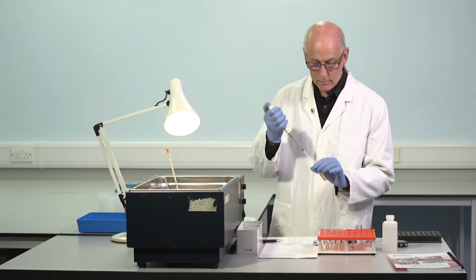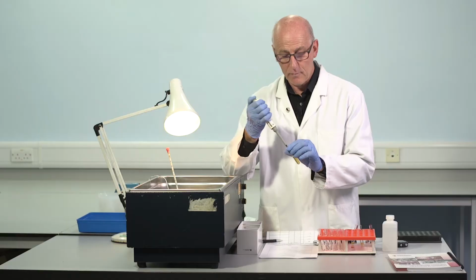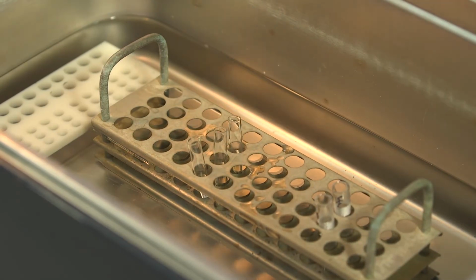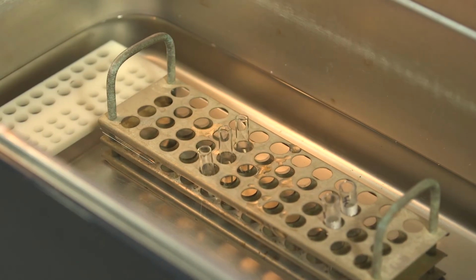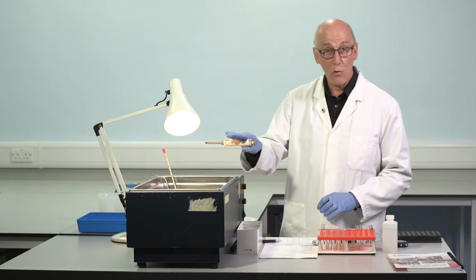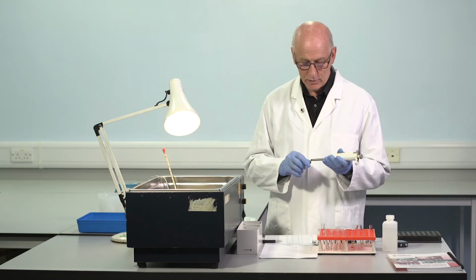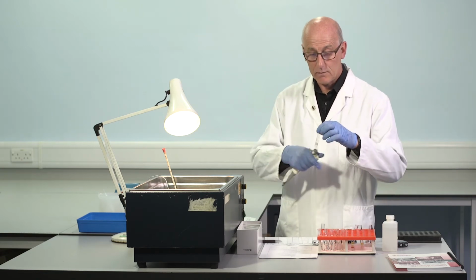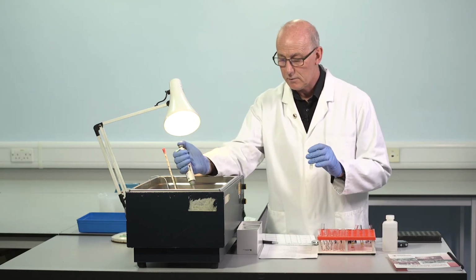So first, 3 tubes, 100 microlitres factor VIII deficient plasma from the same pool of factor VIII deficient plasma that we used for the calibration curve. Simply warming up at the moment. Fresh pipette tip for each operation. 100 microlitres, 0.1 mil, 1 in 10 dilution.